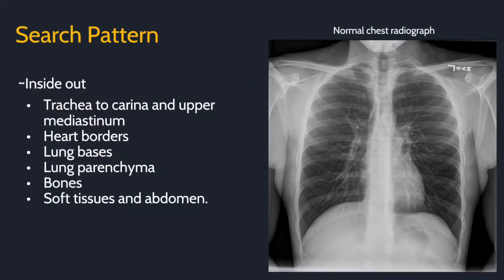There are many different approaches for a search pattern, but here is my approach. I generally start inside out with the carina as one of my main landmarks. Look at the trachea to the carina and upper mediastinum. Then I look at the heart size and the borders. I move to the lung bases and move up to the right lung, down the left lung, and then look at both lungs at the same time. Finally, I look at the bones, soft tissue, and the abdomen.